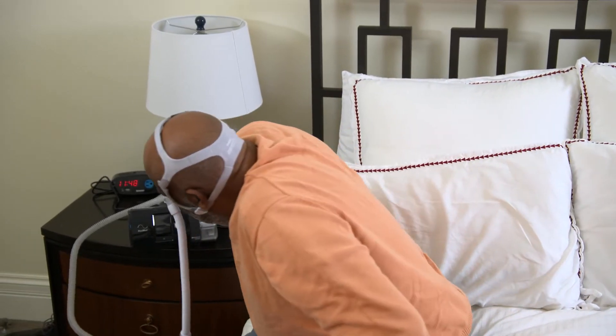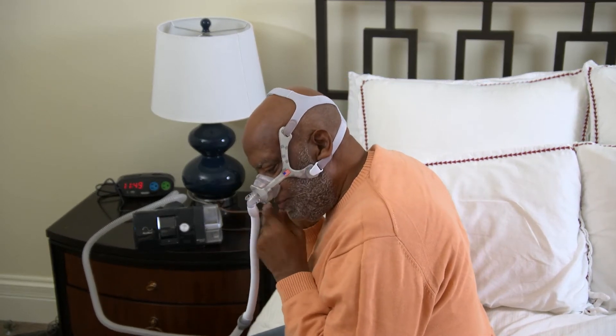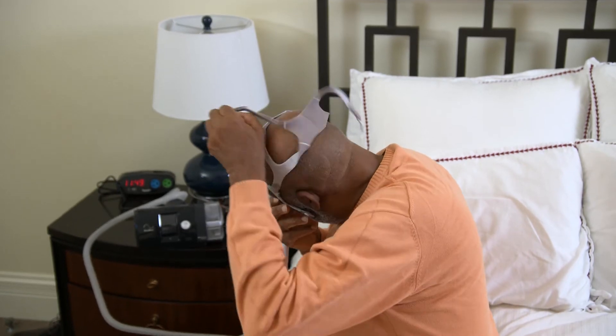Remember, we recommend that you practice these desensitization steps each and every day. That's the best and fastest way to train your brain and body to get comfortable and relaxed with the PAP gear and process. Do it every day and progress through these steps as you feel comfortable.